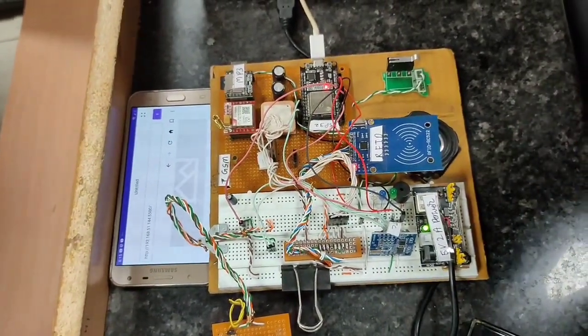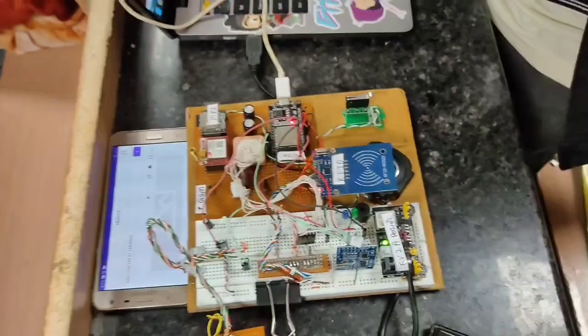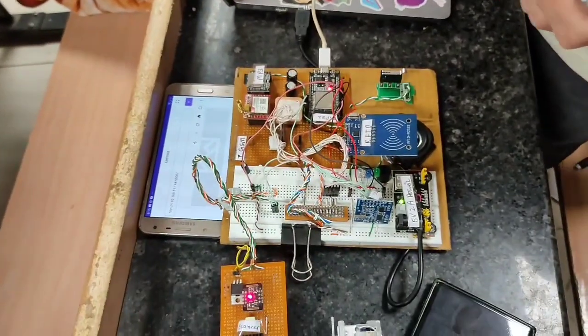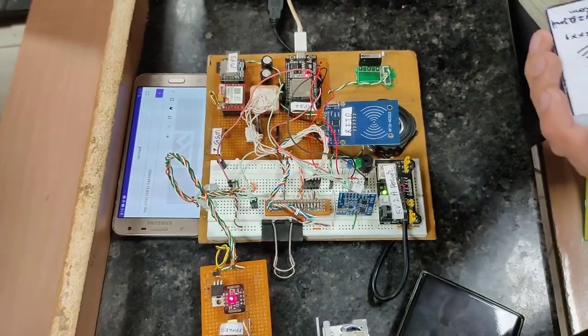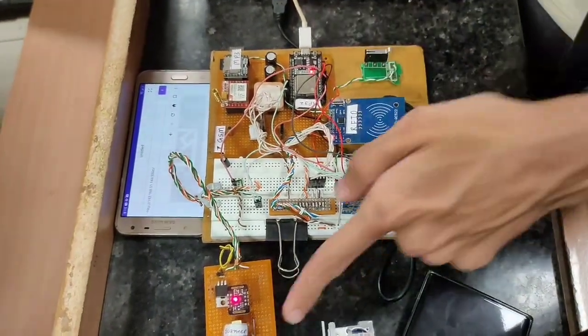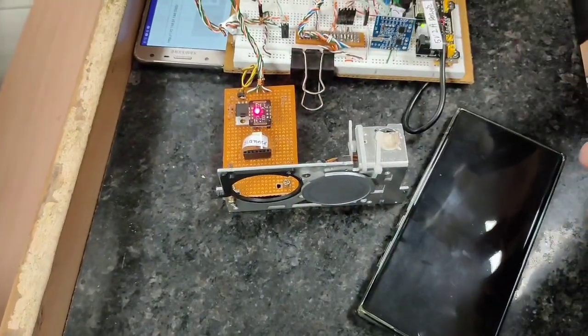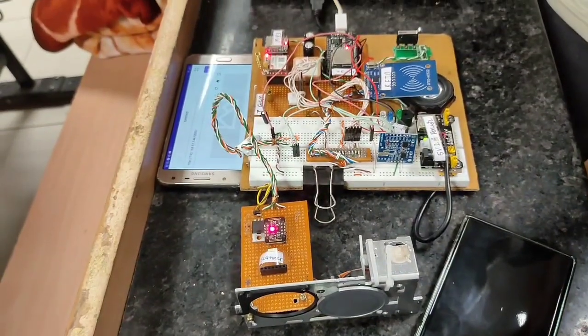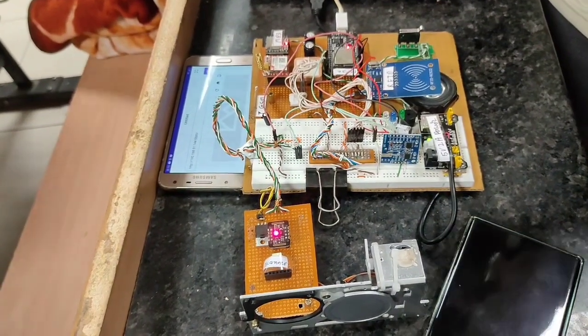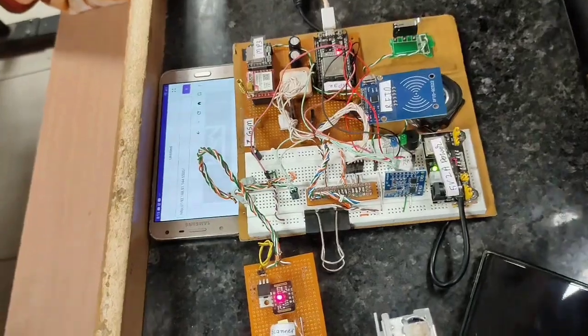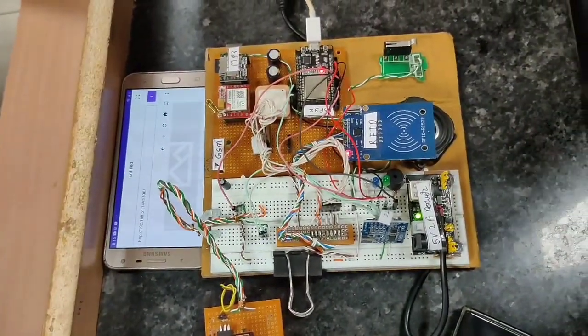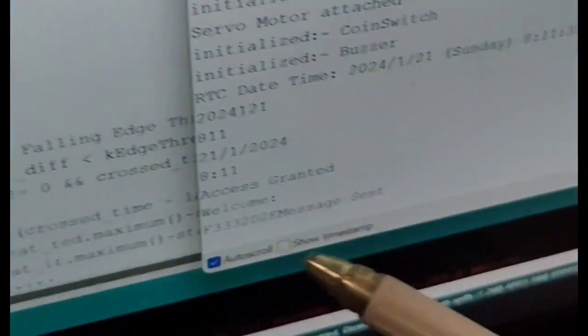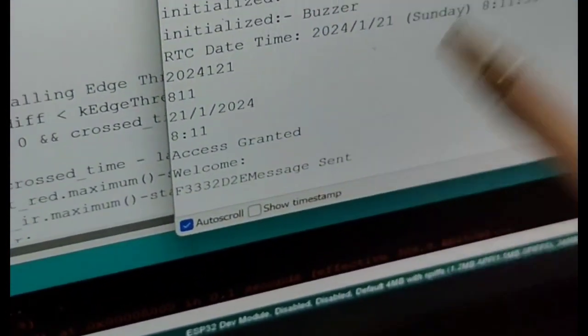Let's see how the flow works for a registered user. If the user is registered, he'll tap the card. As you can see, the door has opened instantly. 'Please enter your mobile number to get reports and advice.' It played a prompt depending on the situation, and the message has been sent. As you can see in the console, the message has been sent to the user.